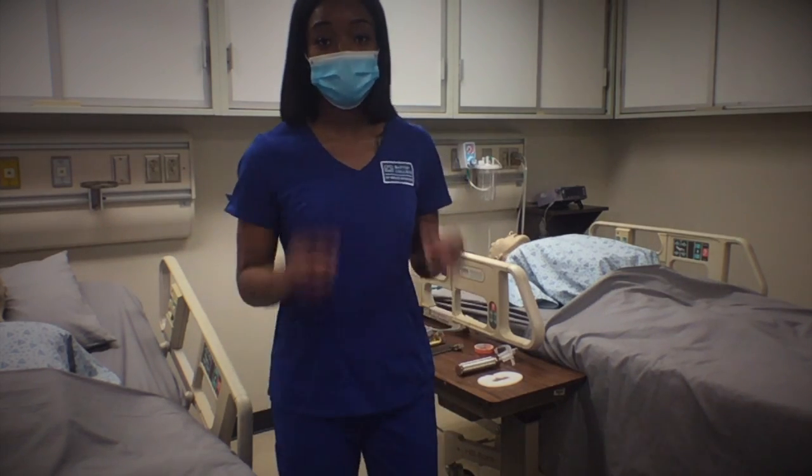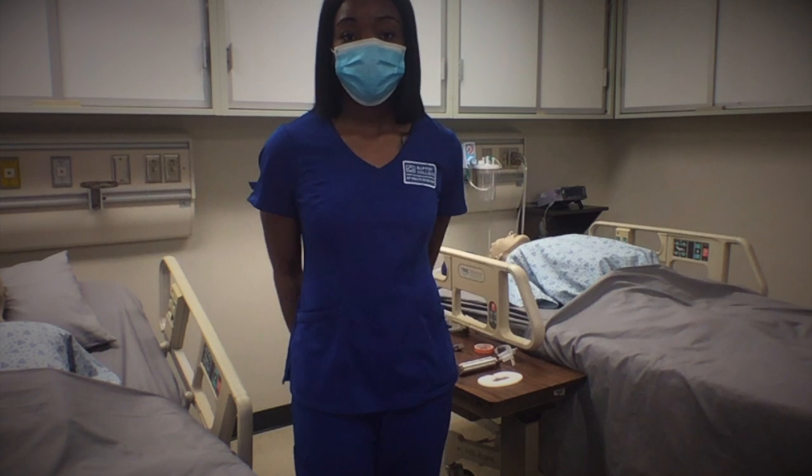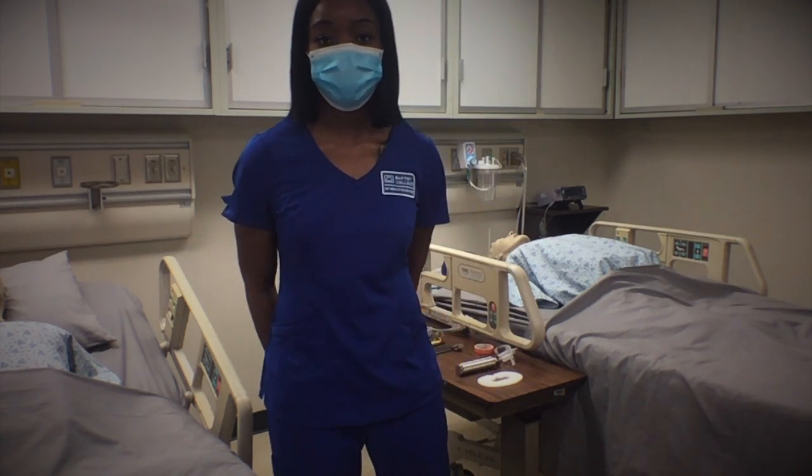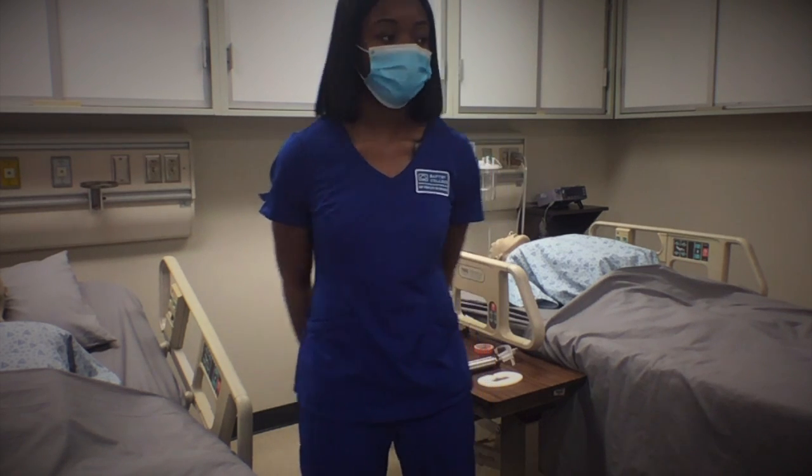His name is Mr. Jones, and the reason for intubation is to open up the patient's airway to improve the patient's ventilation as well as oxygenation.